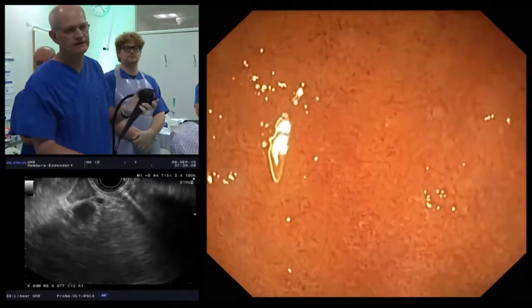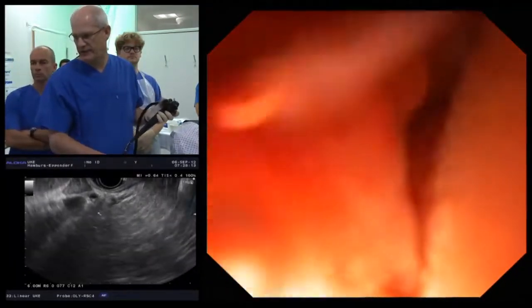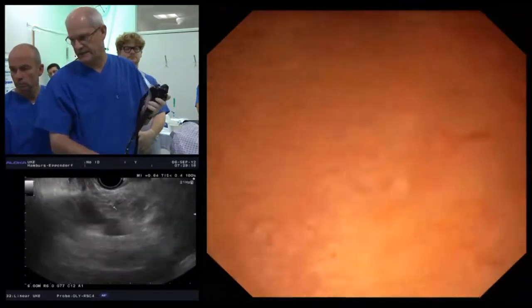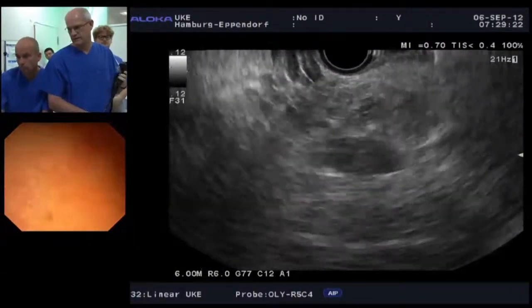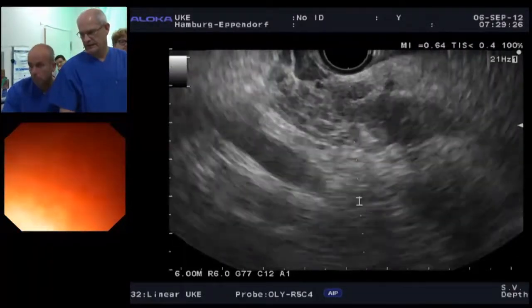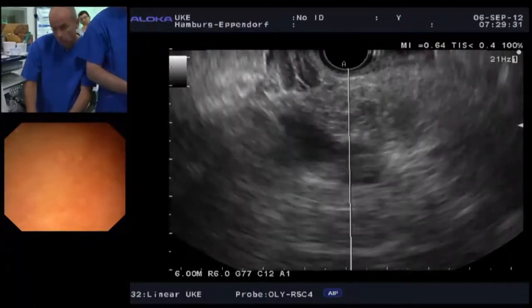In this case, I'm going to inflate the balloon a little bit. Come up on my up down and aspirate air. And then what I'm really looking for is the portal vein. That's what we see in the area of the apex. And then with that we have pancreas just to the right there.